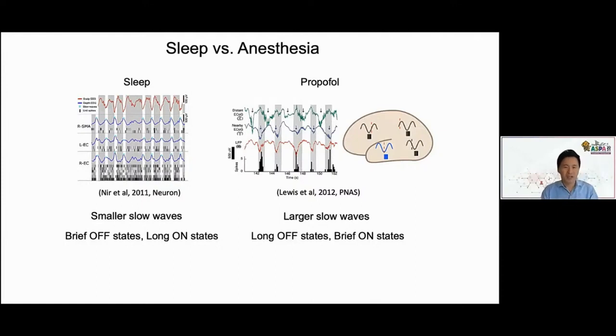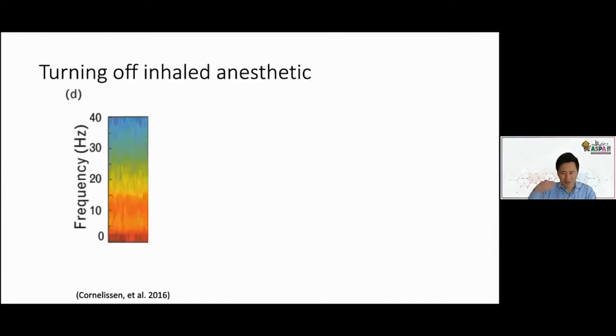So we reviewed those EEG signatures. Now let's look at maybe some case studies. So I want to review certain patterns that we're going to see in the case studies here and in Dr. Bong's presentation. So this is a patient that is receiving sevoflurane and nitrous oxide for maintenance of general anesthesia. I forget how old this patient is, maybe 1 or 2 years old.